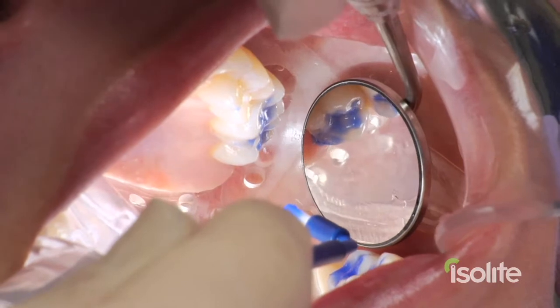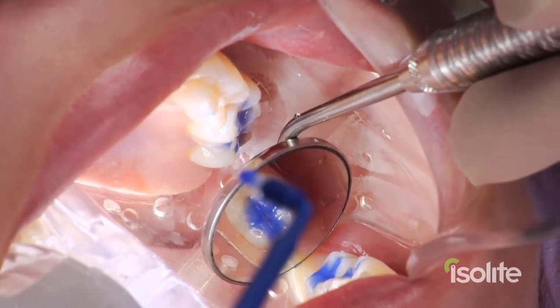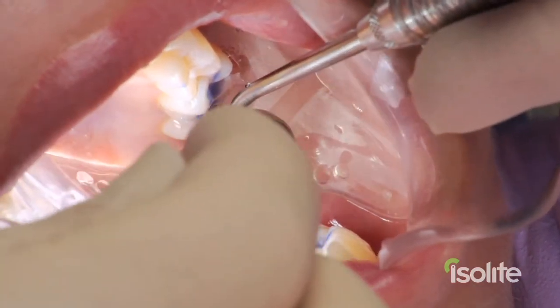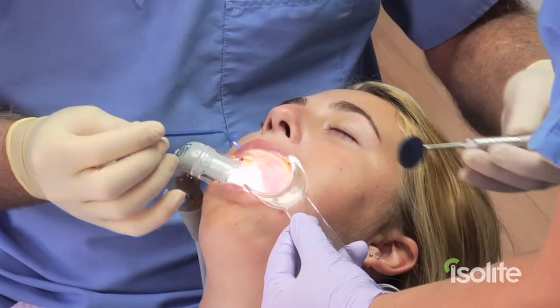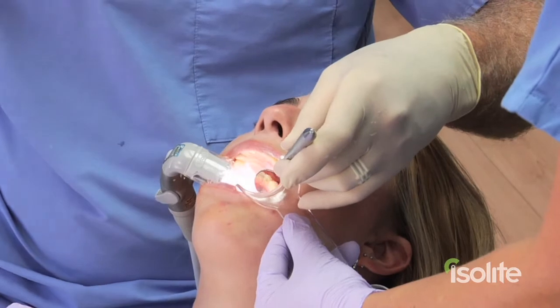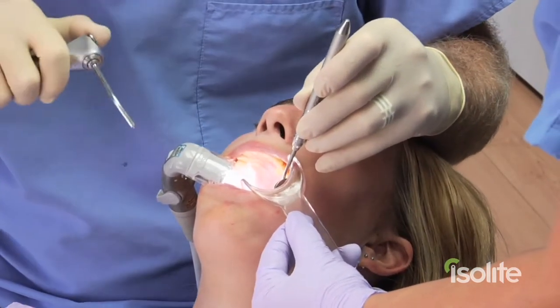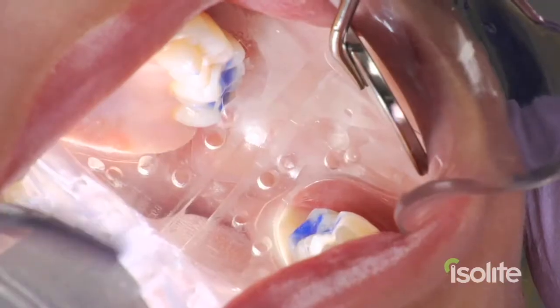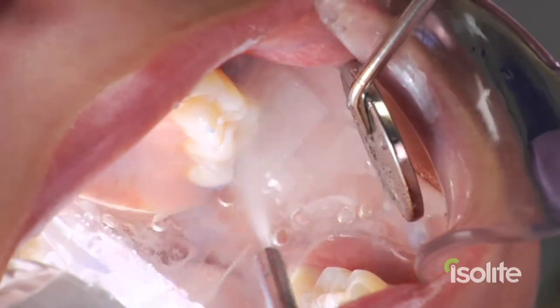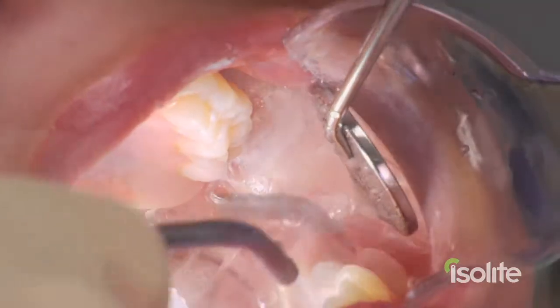There is number 15, there is number 14, there is number 18, and there is number 19. Sealants truly become a single-handed procedure that an assistant, hygienist, or even a dentist can do. It does speed things up a bit when my assistant hands me my instruments and materials. We've now been 30 seconds on the etch. Notice how the Isolite efficiently evacuates the phosphoric acid without it contacting the tissue, and there is no additional suction needed at all.